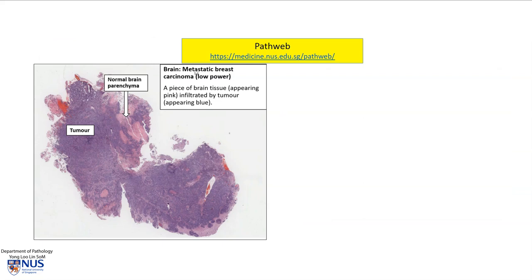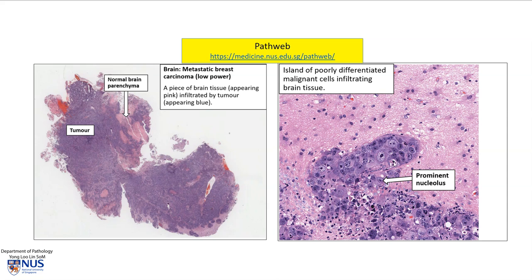Microscopically, this is an example of metastatic breast carcinoma in the brain. At low magnification, the pink area is the brain parenchyma, and we can see the tumor — the purplish area — infiltrating into the brain parenchyma. At high magnification, we can see the astrocytes of the brain parenchyma, and there are large cohesive sheets of very pleomorphic malignant cells. This particular cell is very large with a huge nucleus and a very prominent nucleolus, illustrating metastatic breast carcinoma infiltrating into the brain.